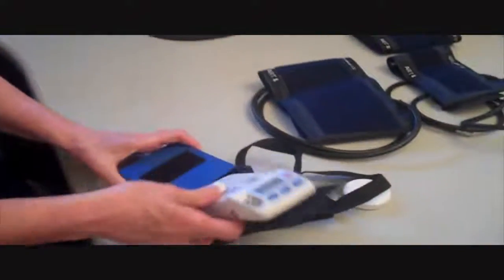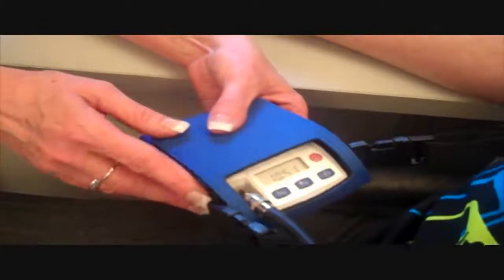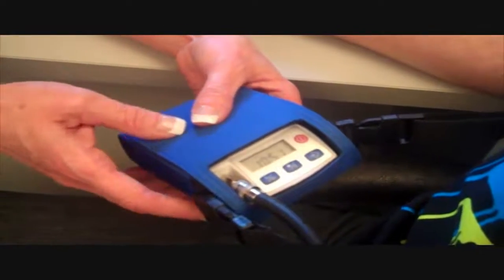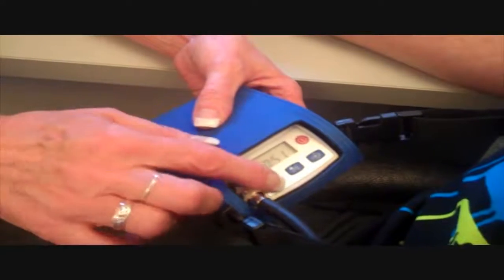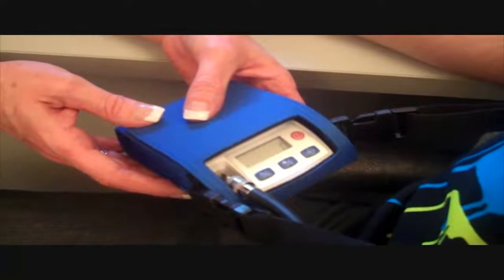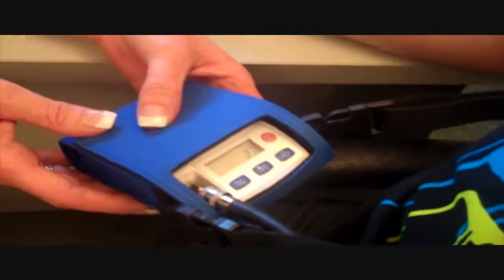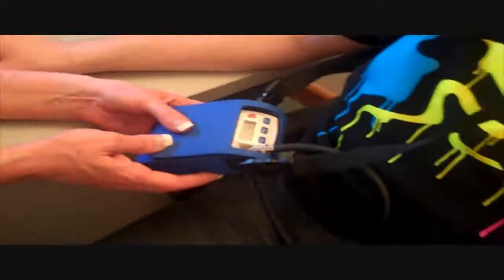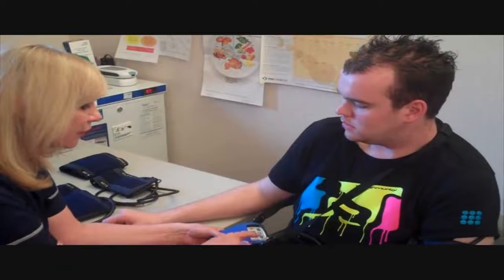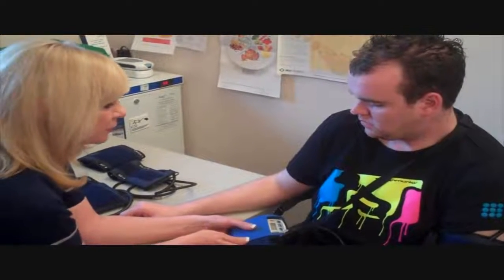We put the machine into the holder. I'm going to take one manual reading now so you can see what it feels like — just tightening up now. It's going to take three readings an hour during the daytime and one reading at night. If you're driving and you don't want it to go off, you can press this button here — just press and hold and it will stop inflating.